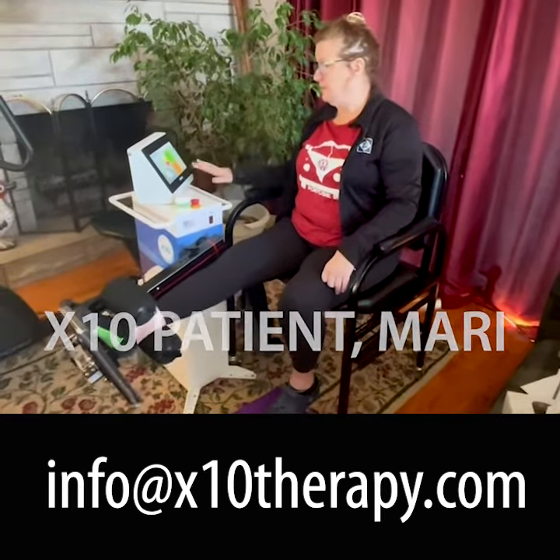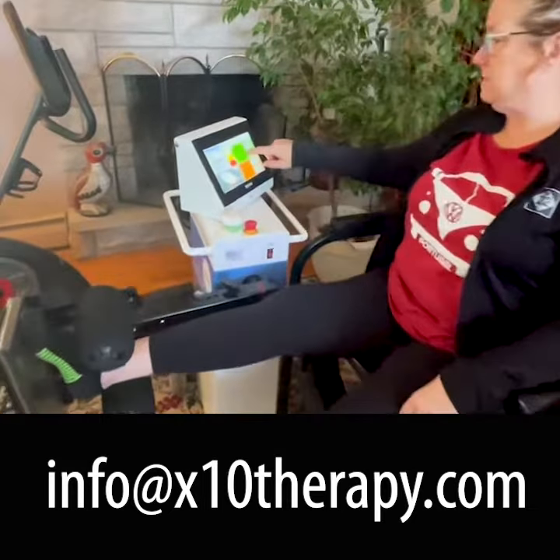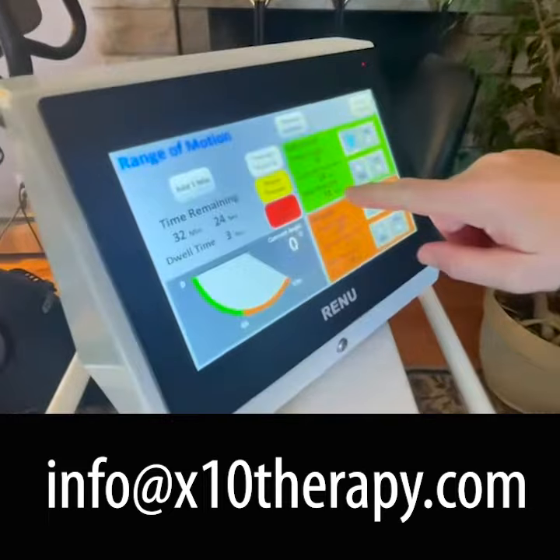This is just a little video of the X10. I'm in extension, my extension's at zero, and with 15, 16 pounds of pressure — max is 18 pounds of pressure.